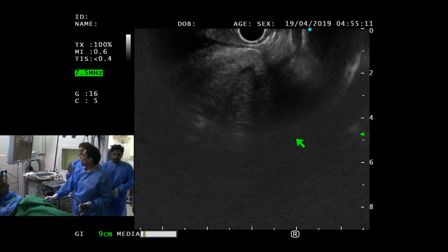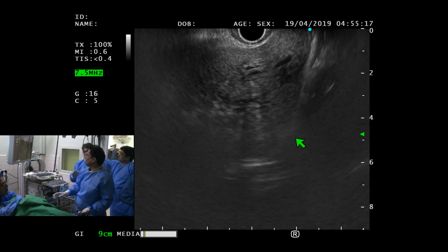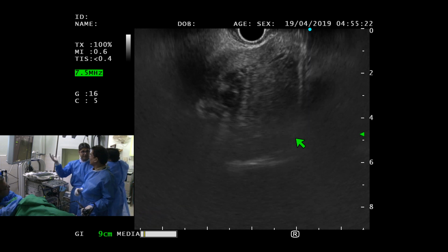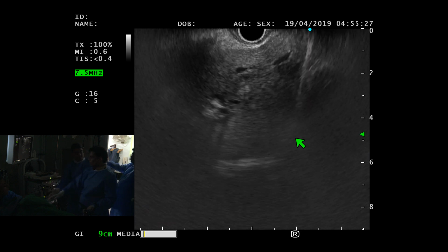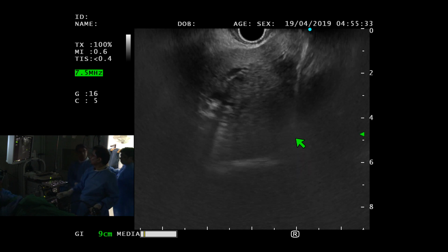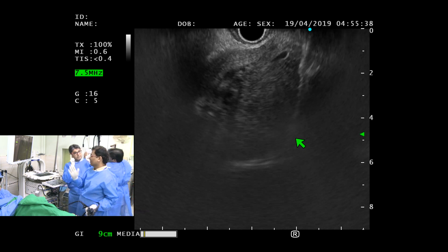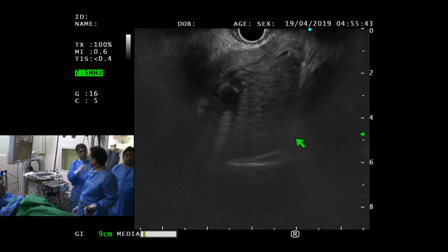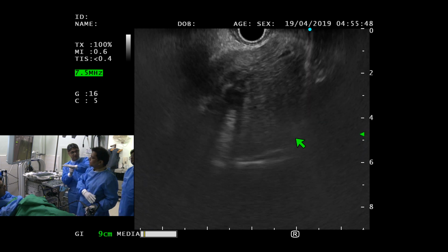Now, we have already discussed that once we see the liver, our right hand at this point becomes useless, because we've got the liver. And what are we now going to do? We will only support, if anything, with the right hand, and the left hand, which is now at the neutral position, should start to come up. Because we know that if the liver is anterior to the patient, then the pancreas is lying posterior to the patient. It's behind it. So now I need to do a maneuver so that, looking from the anterior, I look at the posterior.